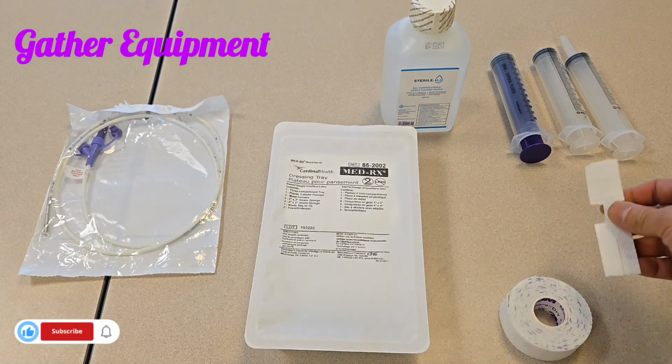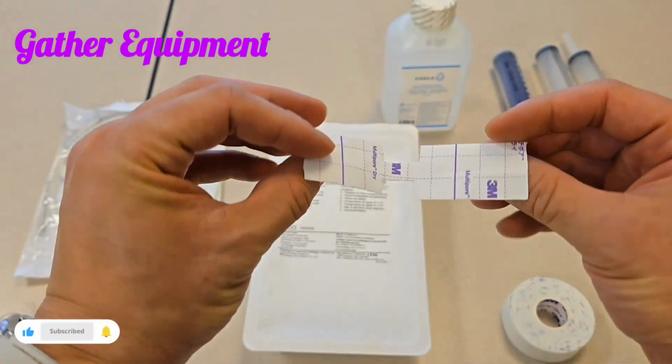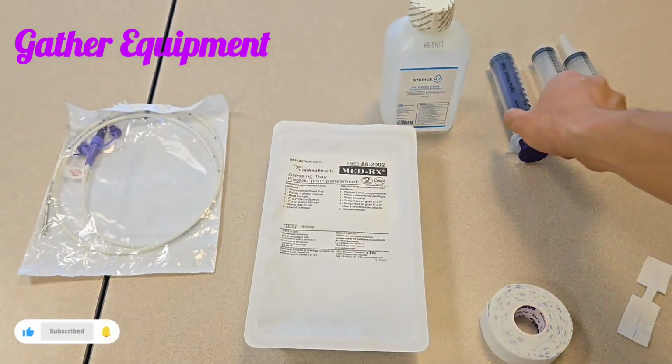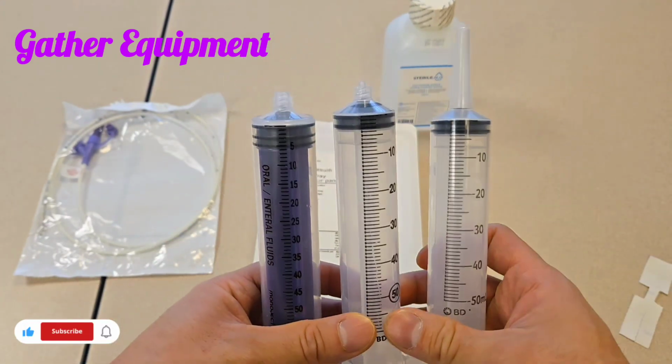Now, if your institution has the NG tape, which looks like a butterfly, you can use those. Here at our institution, we cut our own, okay? And we'll demonstrate how to do that, but it will look something like this. Lastly, we need the purple syringe, which is for the Enfits. We're going to show you that there are actually three types of syringes in there.